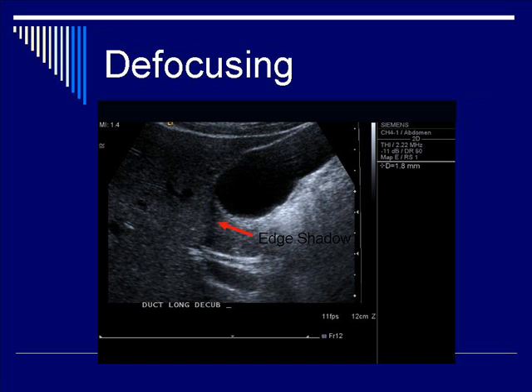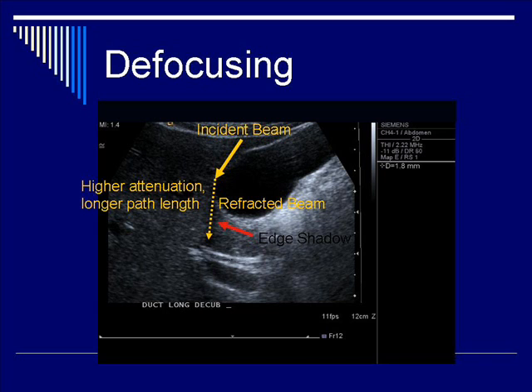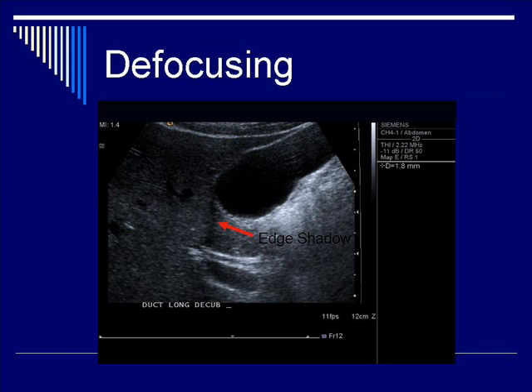On this image, the gallbladder edge has a dark line distal to the curved surface, pointed out by the arrow. Reconstructing the mechanism: the incident beam from the transducer traverses the path outlined by the yellow line, hits the curved surface of the gallbladder, becomes refracted, and you lose a lot of signal from the initial beam. When the signal returns to the transducer, due to higher attenuation from the extra-long path length, much less signal comes back than from surrounding regions, giving you the dark anechoic shadow known as defocusing. This is a beautiful picture of the gallbladder, with the bile duct visible distal to it.